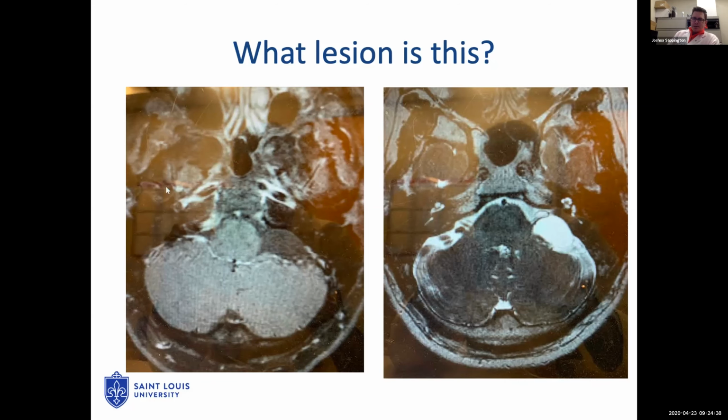It's isointense and does not enhance on T1, and it's bright on T2. Any takers?